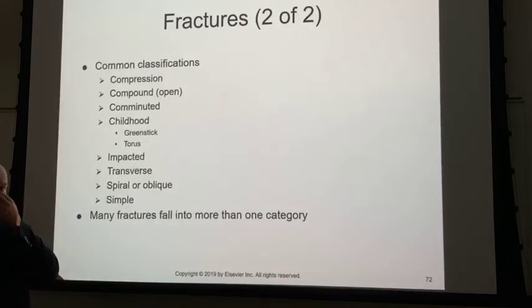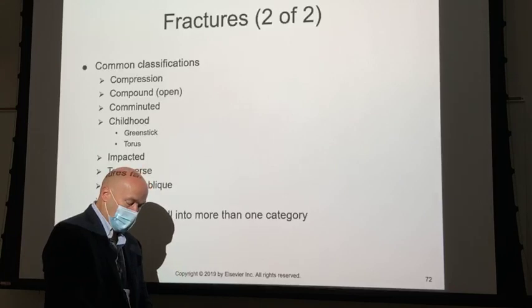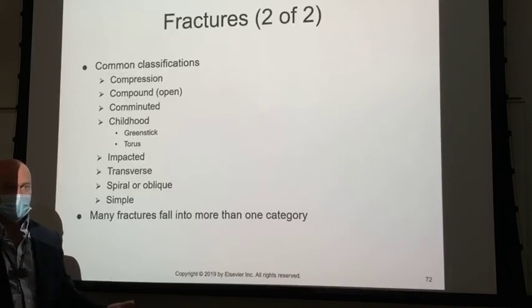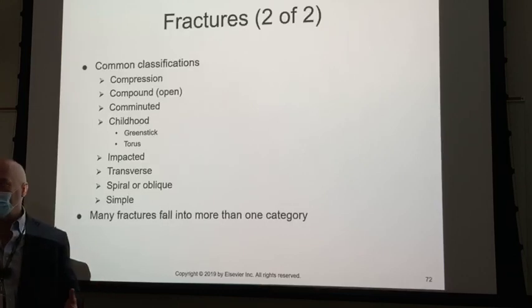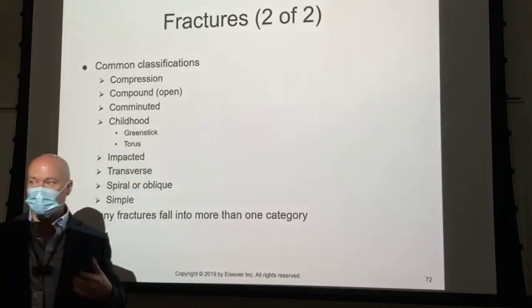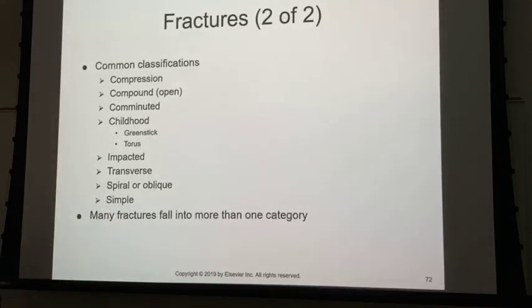Compound fracture, you've got bones sticking through the skin, in a lot of cases blood. Anytime you're taking x-rays of, let's say the tib-fib, the patient's been in a car wreck, and they're still on a backboard, and you get an order for a leg, you walk in, and the knee is straight, and the foot is on its side, put on gloves. Sometimes you'll reach up under the patient, they've cleaned off the backboard, but they haven't lifted the patient's leg and cleaned up underneath it, which they shouldn't. What you'll find after you get your hand up under there is they've got a compound fracture and it's completely bloody. So if there's an obvious fracture of a long bone, go ahead and put your gloves on so that you don't get exposed to the blood.